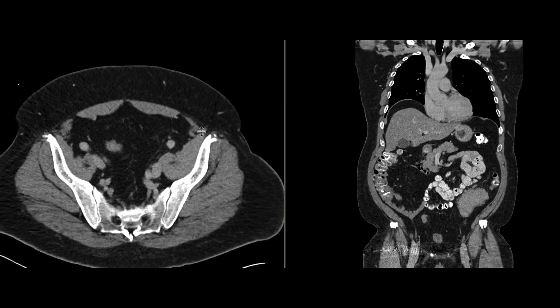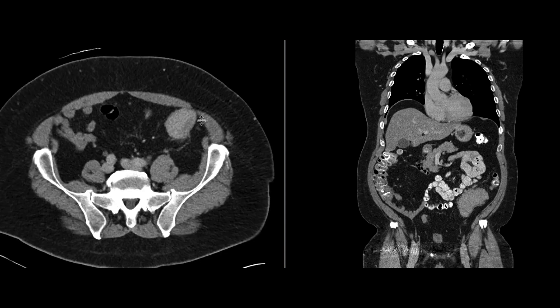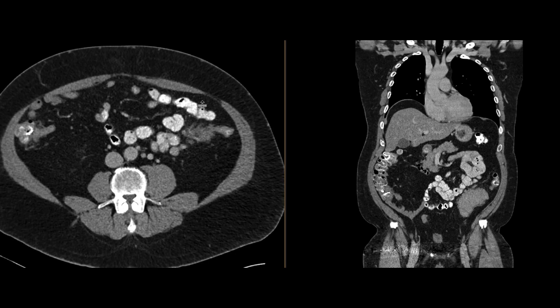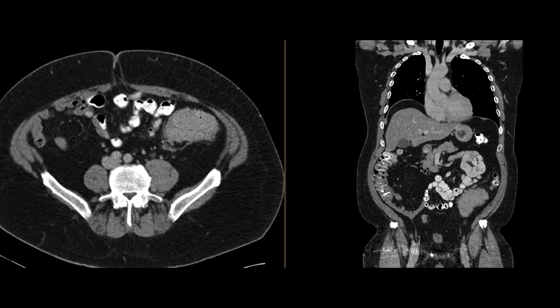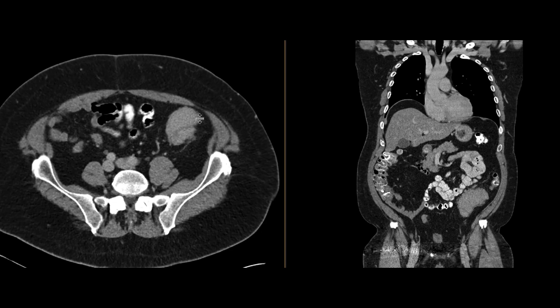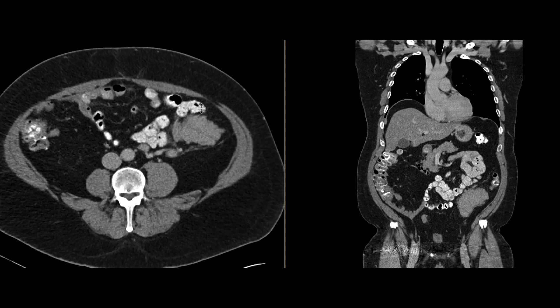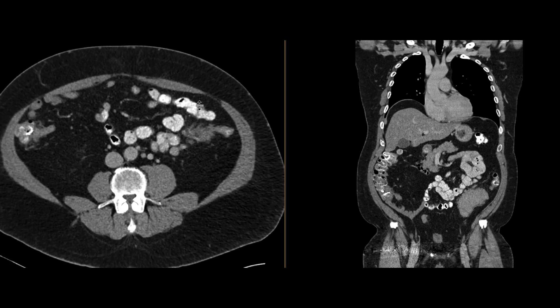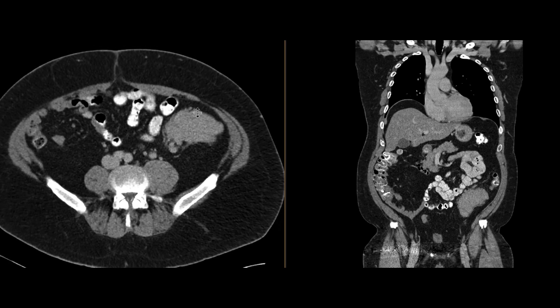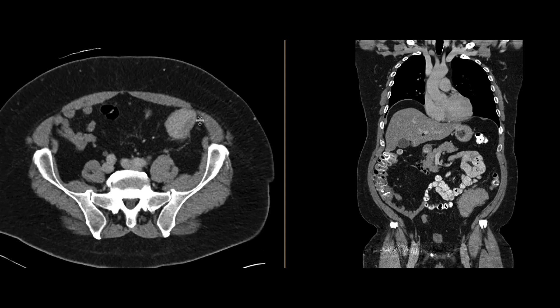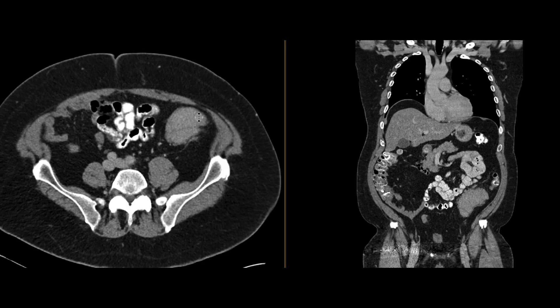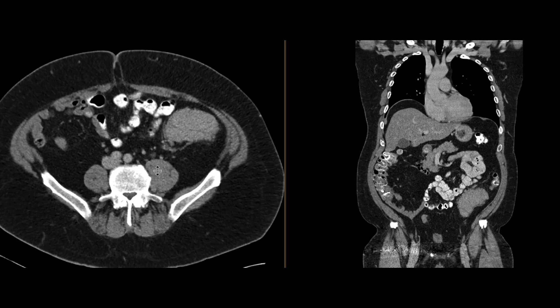There are a number of things this could be. If you think about bowel masses, certainly adenocarcinomas — but typically those will cause some degree of bowel obstruction, at least when they're of this size. Gastrointestinal stromal tumors could also give you this appearance, but they're seldom associated with any adenopathy.